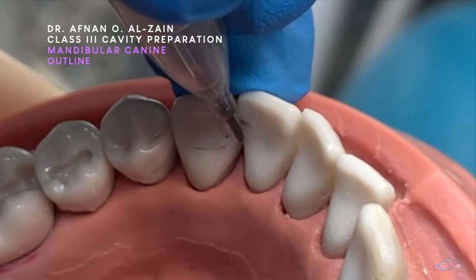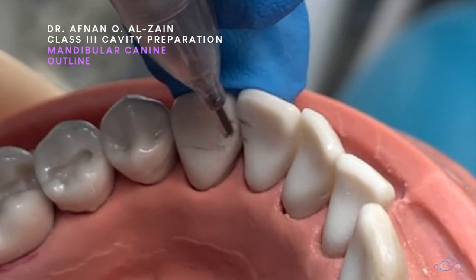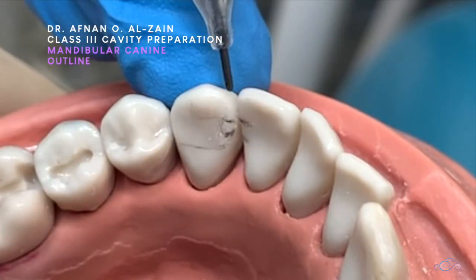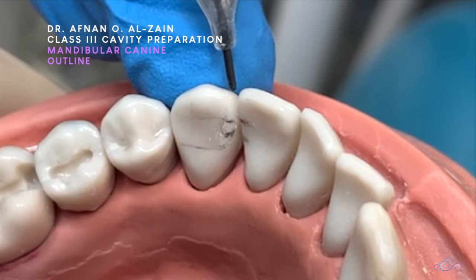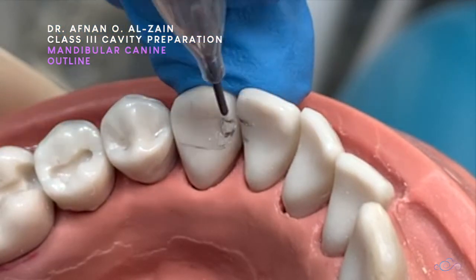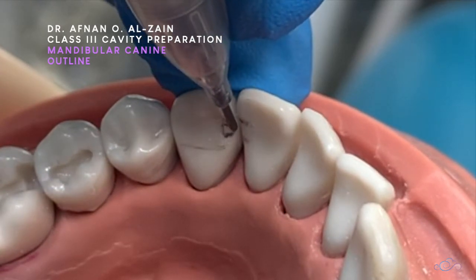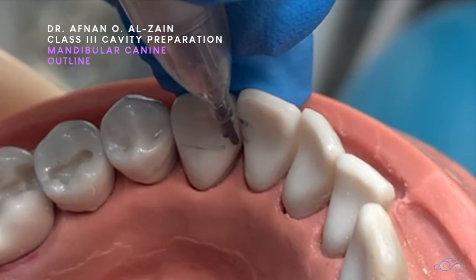The contact area — we're going to go a little bit below, because the contact area is sub-contact. We do not involve the incisal angle, and we'll have class four. So we'll be here within the middle third, or it will be a very small conservative cavity in the proximal.